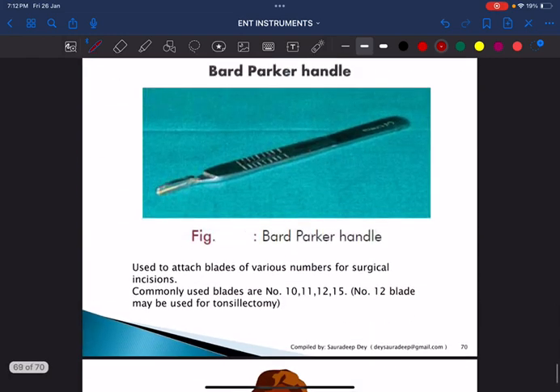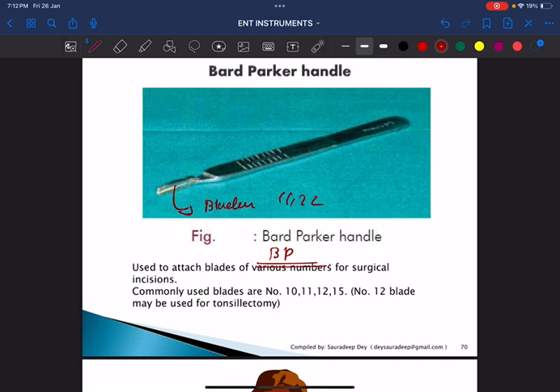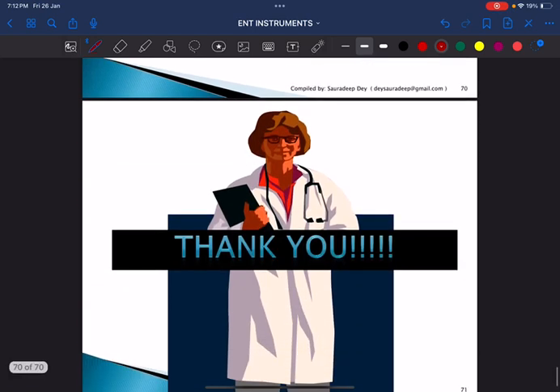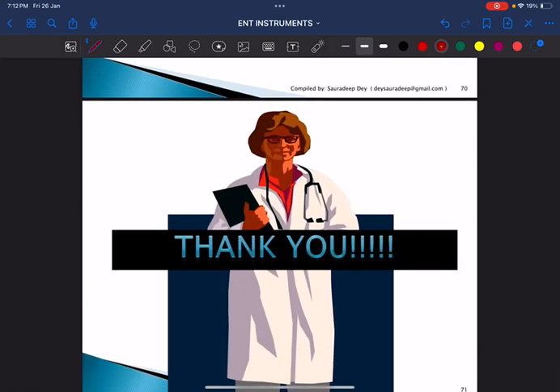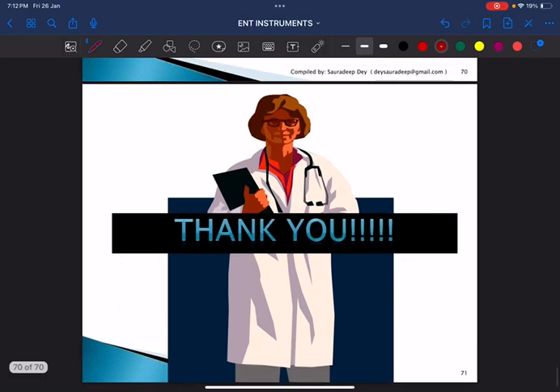This is the commonly used BP handle, also called the Bard-Parker handle. Blades of various numbers — such as 11 and 22 — are fixed onto it, used for cutting and major incisions during surgery.